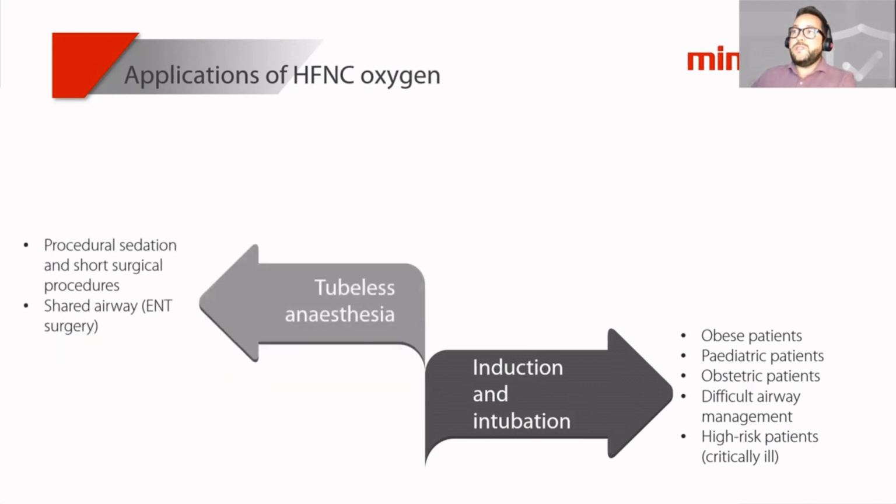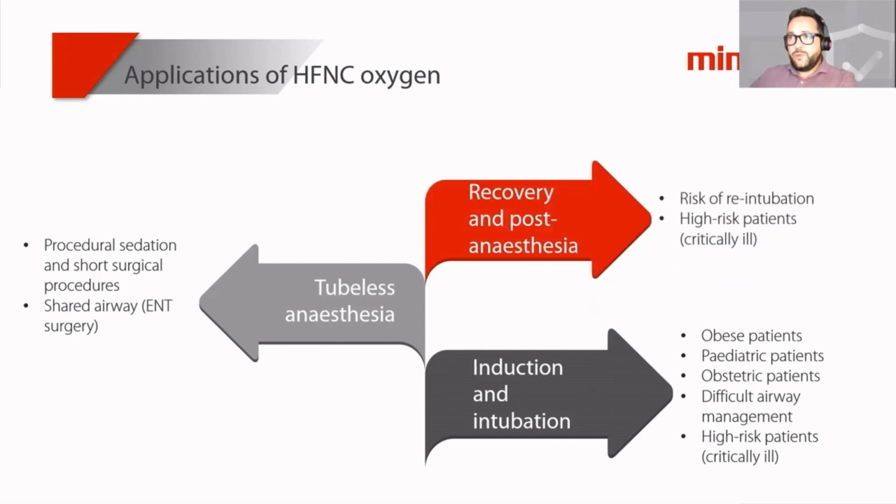Therefore, using the same principles, we already know that high-flow nasal cannula can also prolong the safe apnea time for tubeless anesthesia and maintain the patient airway for optimal oxygenation and carbon dioxide removal, while the surgeon needs to access certain parts during ear, nose, and throat surgery. Also, during anesthesia recovery, the management of high-risk patients can be enhanced with the use of high-flow oxygen, as well as avoiding the risk of a potential reintubation.